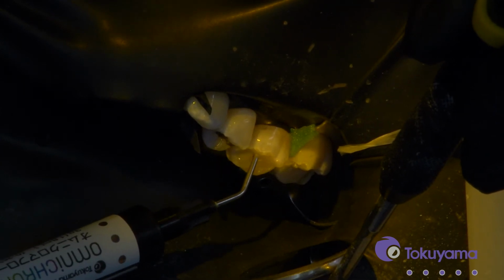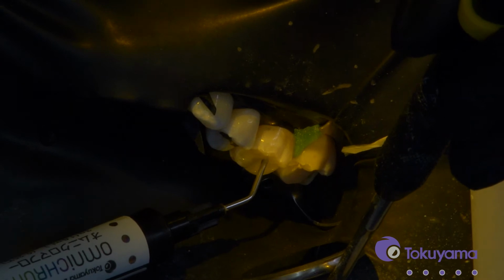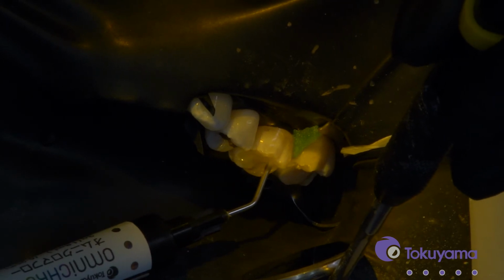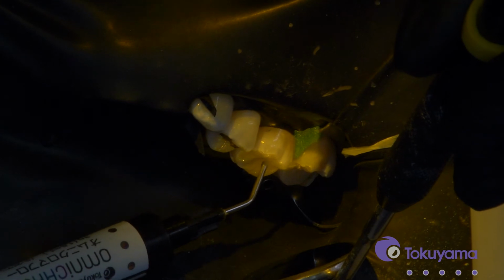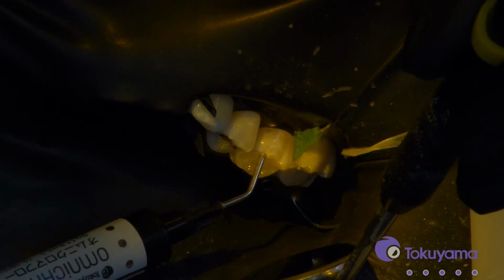You can build up your cusp tips with this, or you can do what I'm doing where I'm placing this restoration and I'll build my grooves in a little bit later. And I'm just kind of dragging it over the cavo surface margin so I don't have any voids and I have nice sealed restorative margins. Okay, Polly, we're all set.